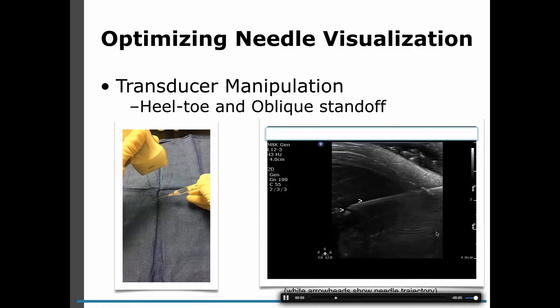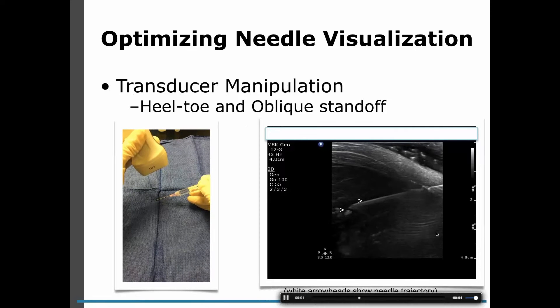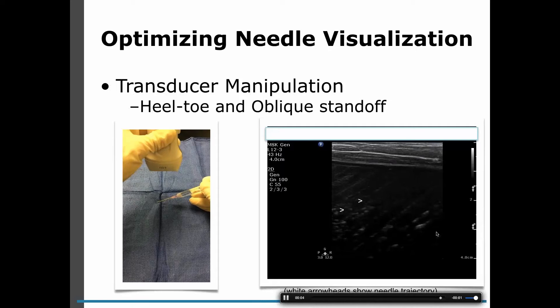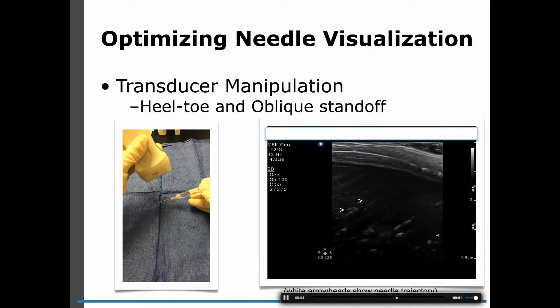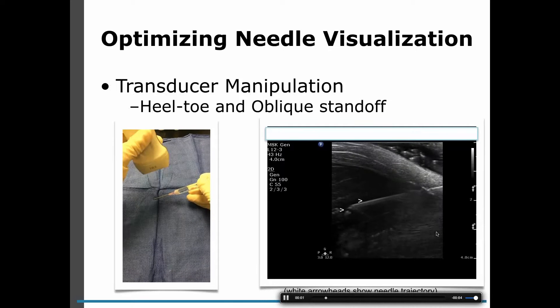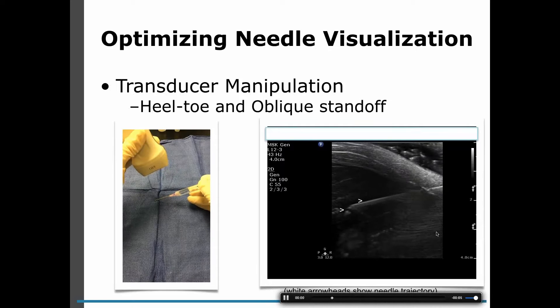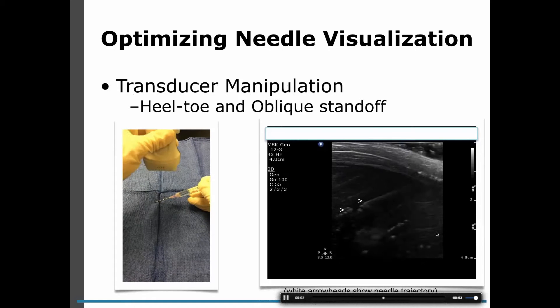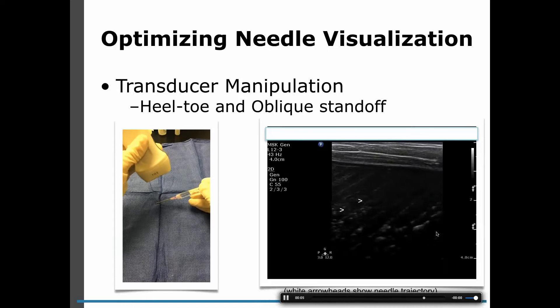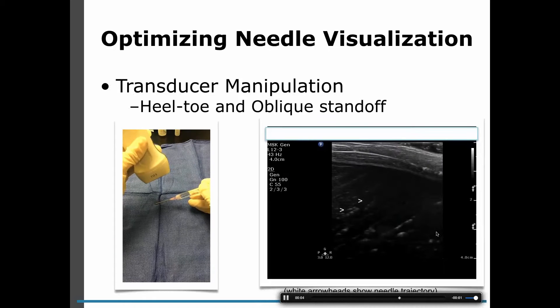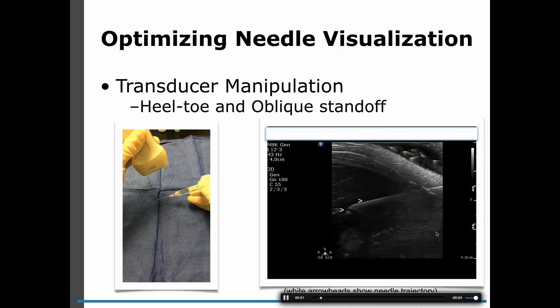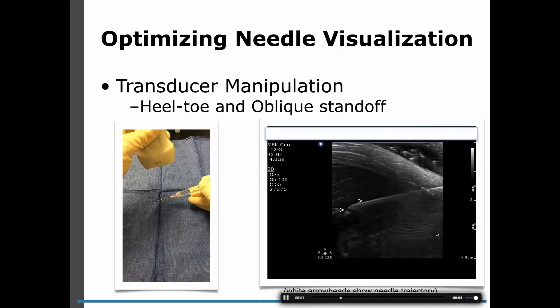The screen on the right shows what this looks like. As you stop the oblique approach, you'll see the needle become more hypoechoic and anechoic, so you can't even see it. And as you then use the oblique approach, it becomes very hyperechoic and easier to see.